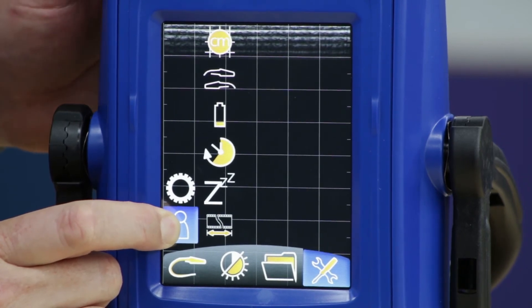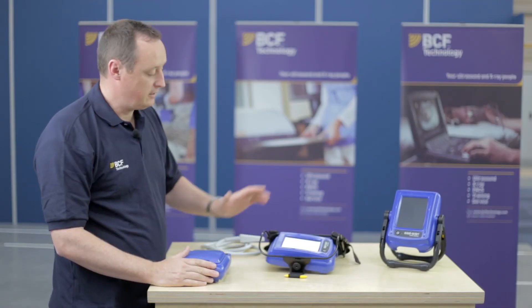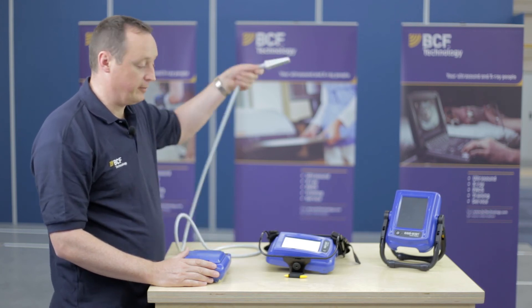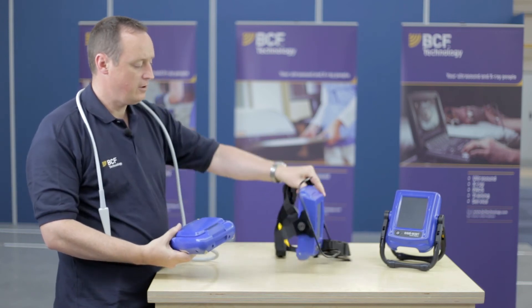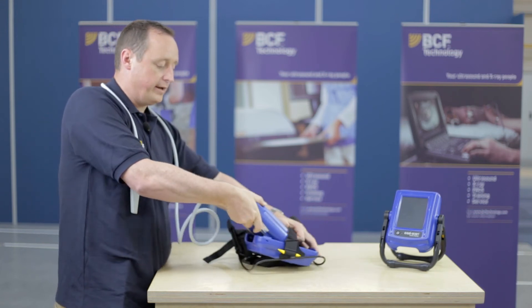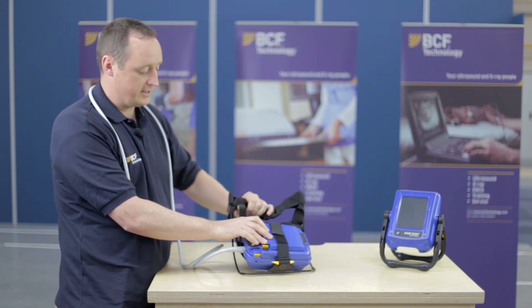Now we're in a good position to connect our EasyScan to our smart display harness. The first thing is to look after the probe — put that over your head or neck, flip your smart display over, and pop that into the smart display. You'll hear it click. There's a Velcro strap on the back which is connected.